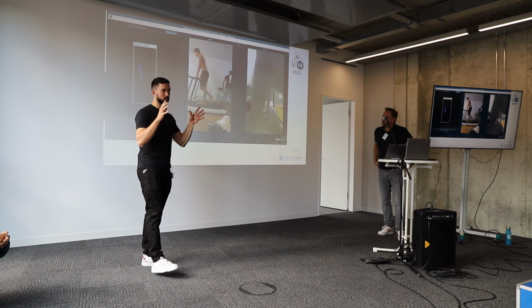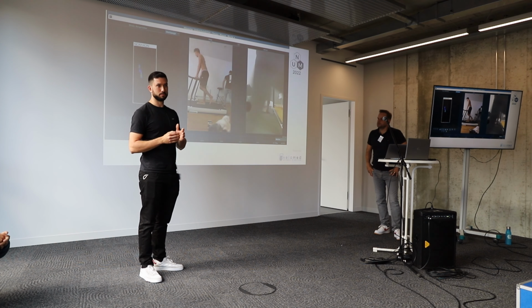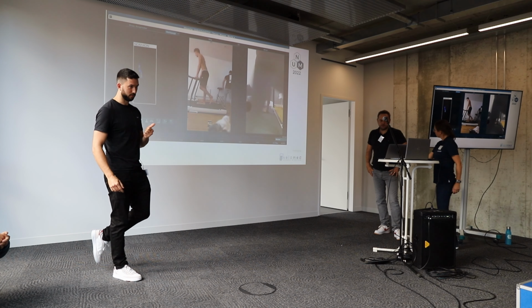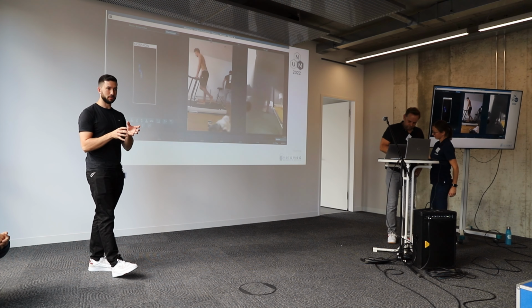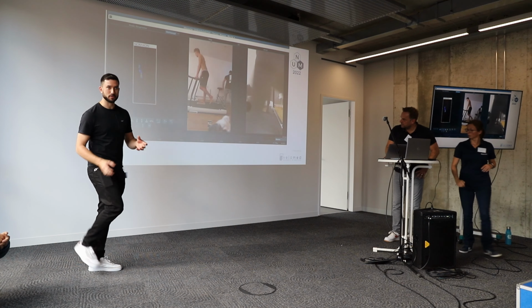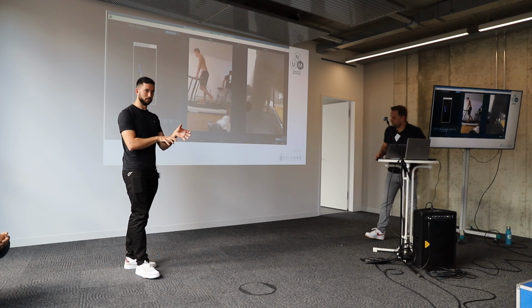So we did something like a test battery, which we do with every patient or every sports guy, which includes gait, which includes normal stance on one leg, which includes, do you perhaps know these blackboards? You can choose which part of your foot is stable, which part of your foot is moving.